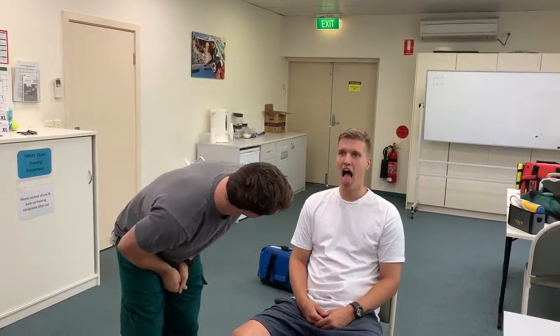So there's no sort of air obstructions or deviated nasal septum or anything like that going on. So what we're going to do is quickly go through the Mallampati score assessments. So we're just going to have a quick look. We're going to open his mouth, put his tongue out. Cool, so I've got a good view all the way down.